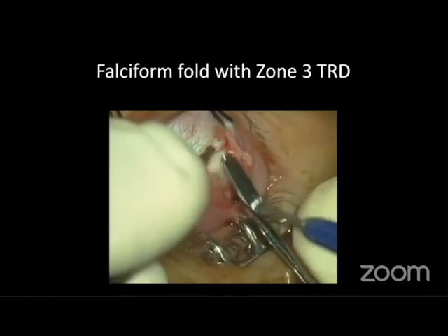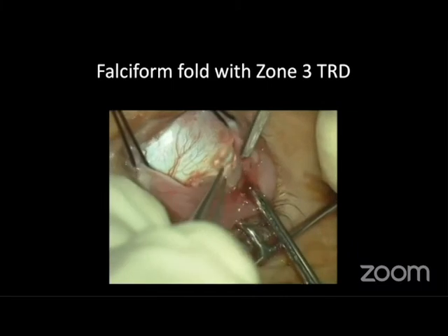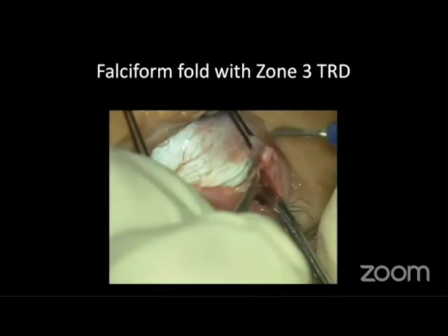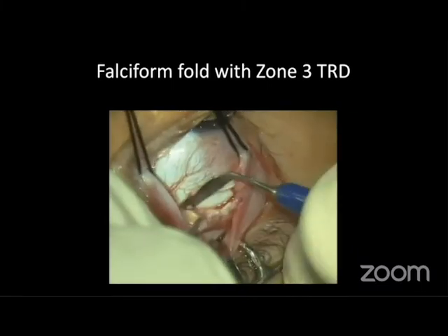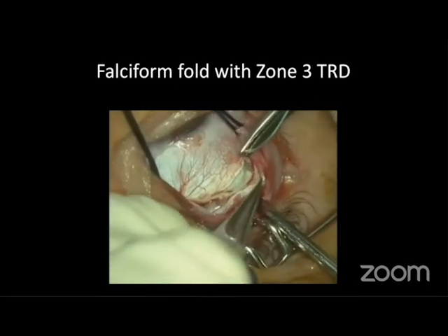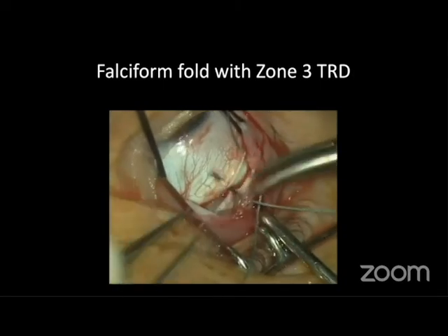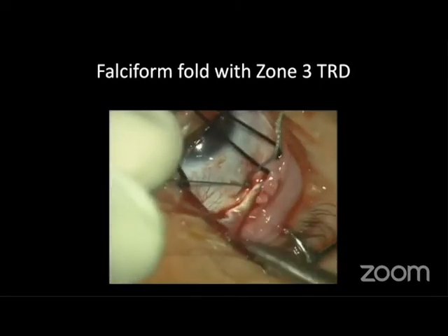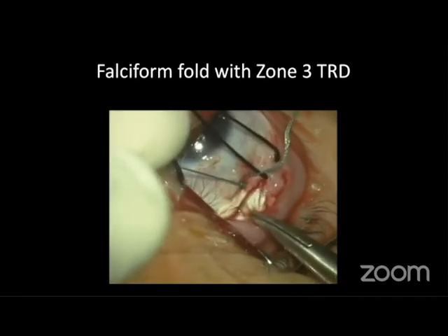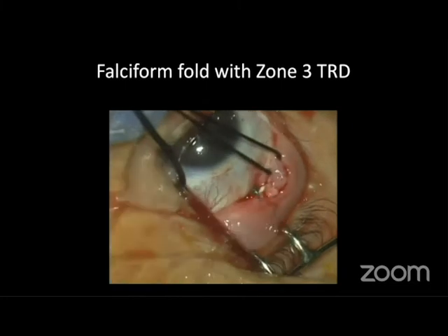Sometimes in zone 3 TRD, where the traction is extremely anterior, we may be forced to do a lensectomy, and I would resort to this scleral imbrication, because I wouldn't want to do a lensectomy. Even with lensectomy, sometimes the fibrous tissue is integrated into the pars plana, and we may not be able to relieve the traction adequately by going inside. So in such a situation, I shorten the sclera instead of extending the retina.